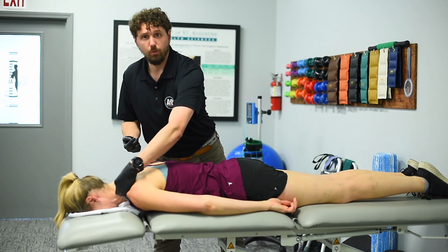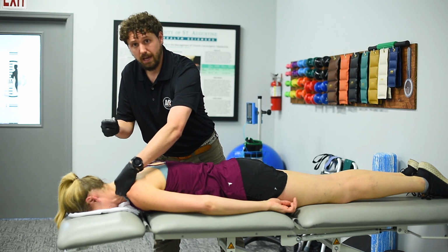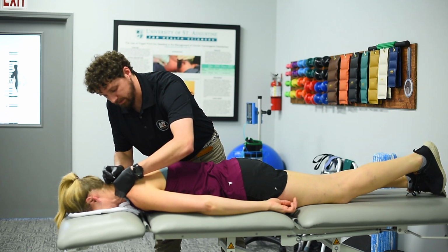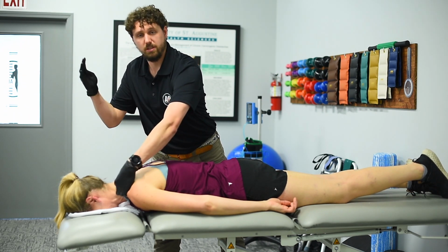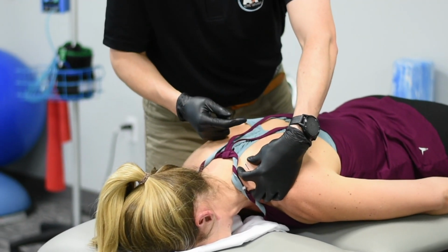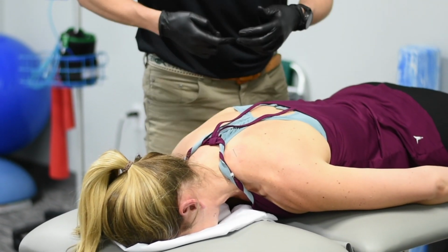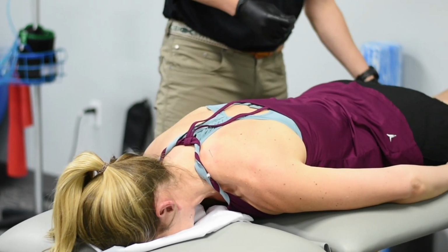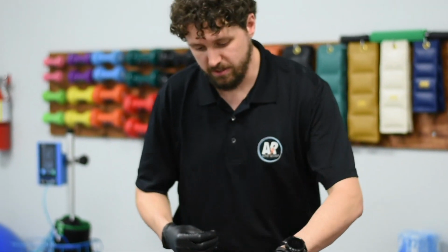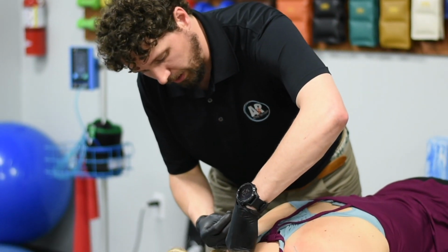In the upper traps, when the person does well with it, I like to release multiple trigger points if I can, so I end up moving that needle around just a little bit and find those trigger points, and you'll feel it twitch and release. That's the goal there. So say I have a good spot in the trap there, I'll move over to her other side. Maybe she has another little trigger point on this side, and so on the right, same kind of thing.